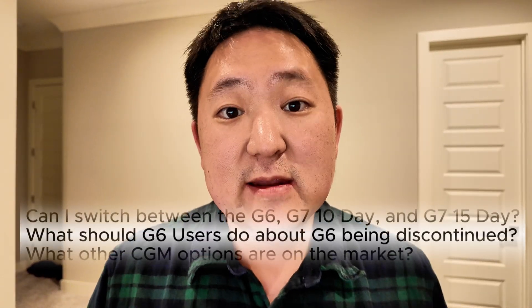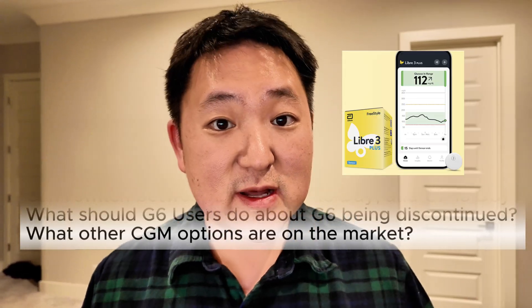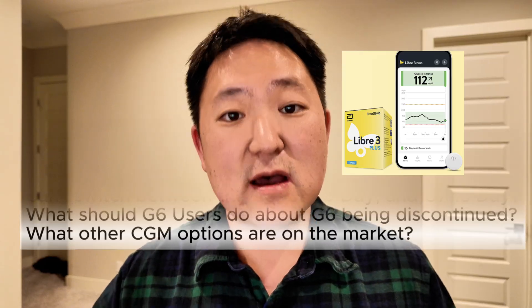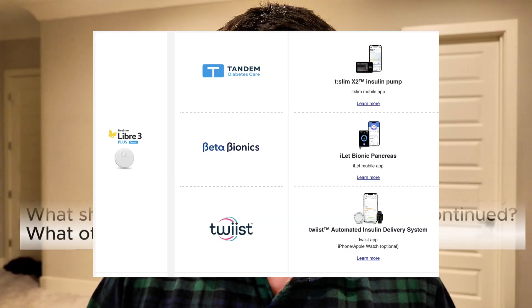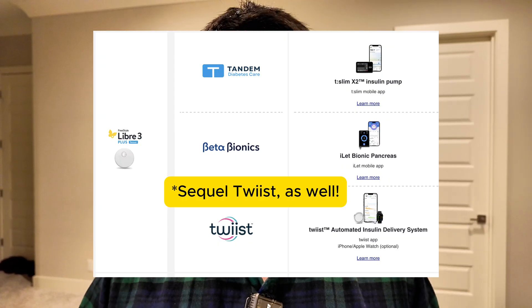Try switching to the G7 15-day and see if it works for you. If the G7 15-day proves itself to you, that's the best case scenario. And if it doesn't, the great thing is there's great competition on the market. The Freestyle Libre 3 Plus is becoming compatible with more and more automated insulin delivery systems — it currently integrates with the Beta Bionics iLet, the Tandem X2 insulin pump, and it should very soon be compatible with the Omnipod 5 and Tandem Mobi as well. It's also compatible with the Medtronic 780G under the different name, the Medtronic Instinct.